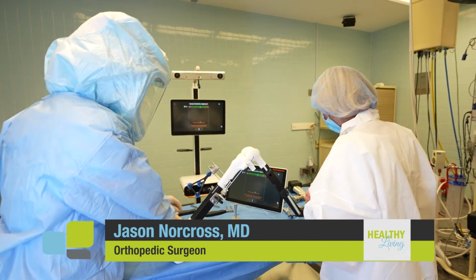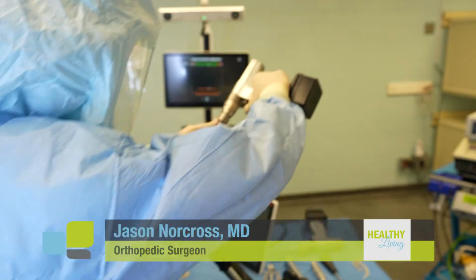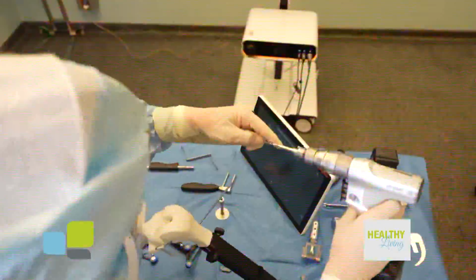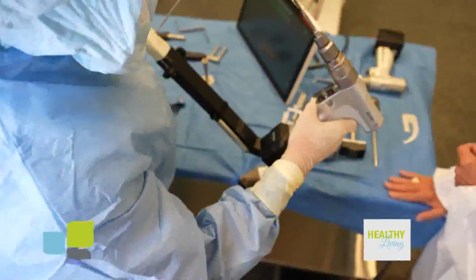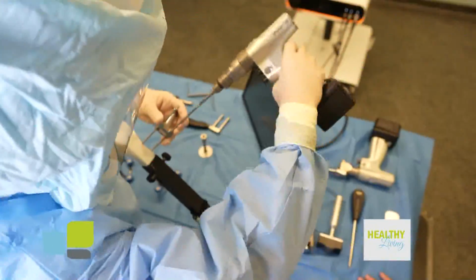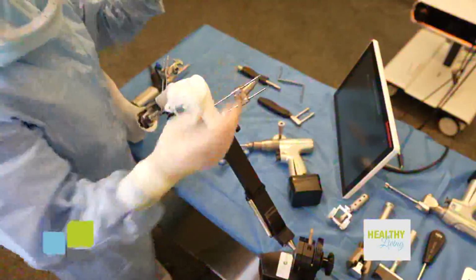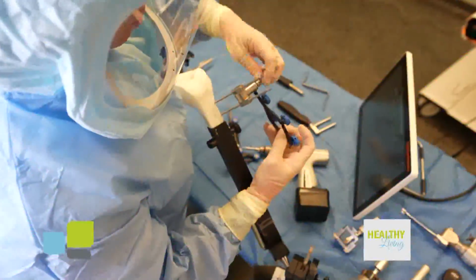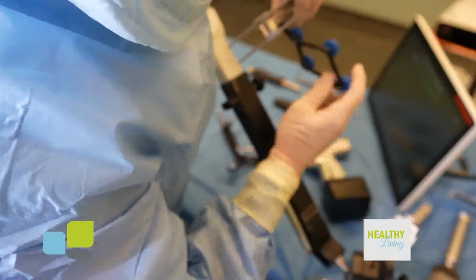Wow. So let me put the pins in and we'll get started. So this is to show you how these go in through separate stab incisions. Look at this. And we use our array as a guide. This holds the trackers. Okay. So now we attach our array. And that is to get a position? This is so the robot will recognize exactly where the patient is in space.